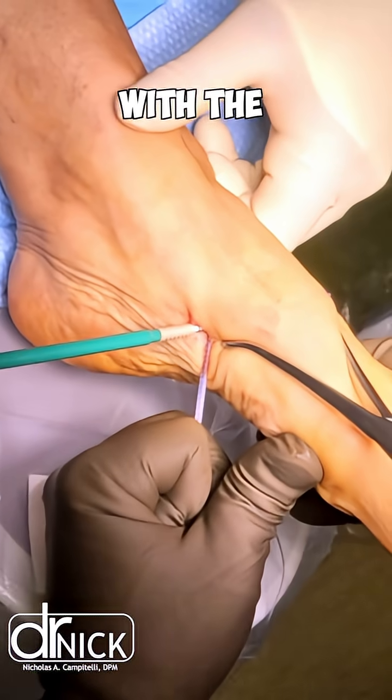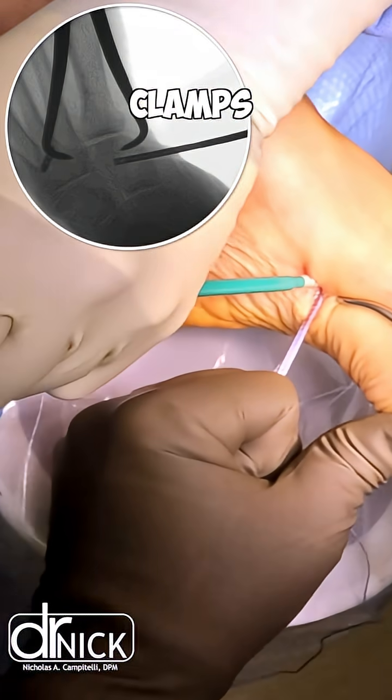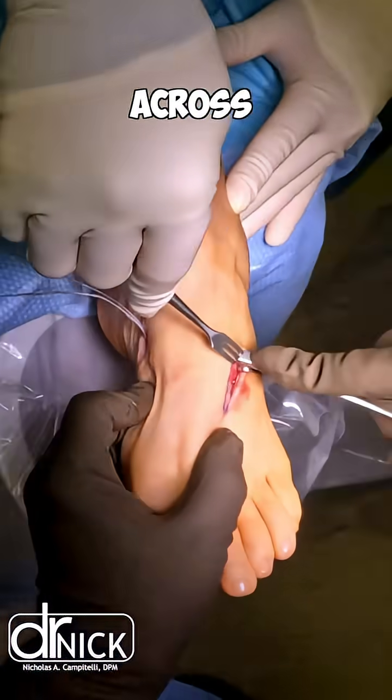We tighten our internal brace with the use of pelvic reduction clamps. The tenodesis screw gets inserted across the medial cuneiform.